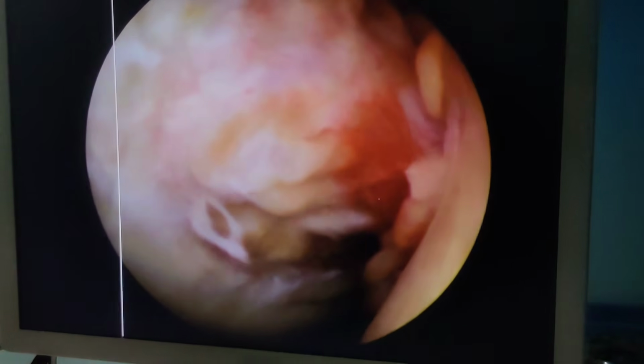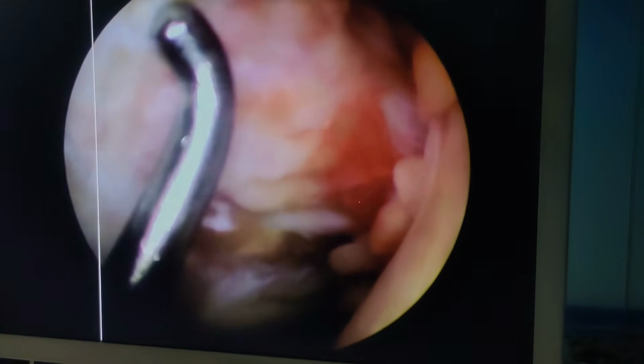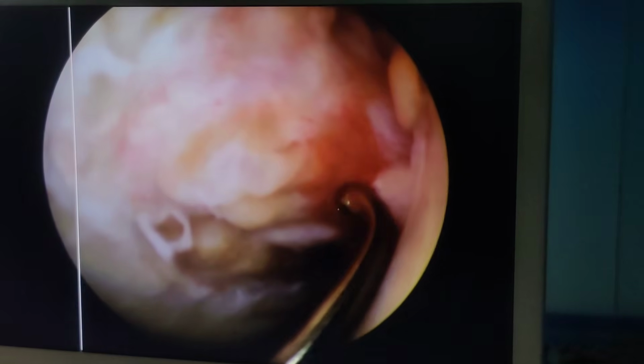So I am in my high and tight anterolateral portal. This is the scope that it's showing. Now unfortunately our main scope has malfunctioned. I am trying to get another one so that we can show you better.